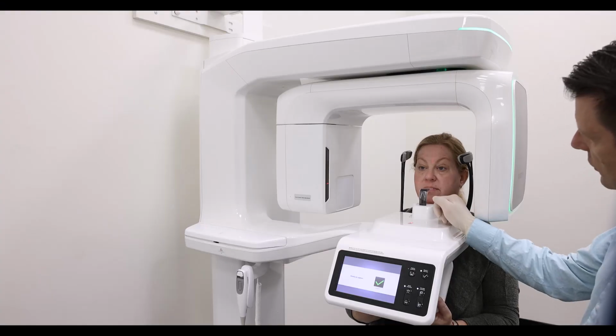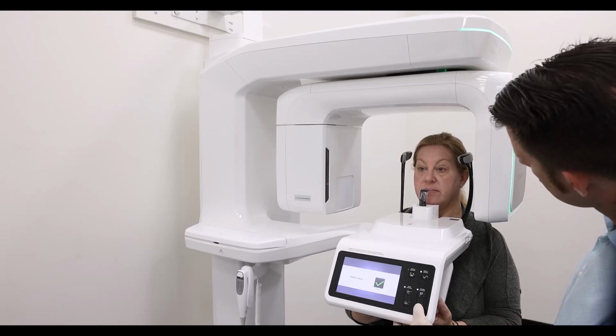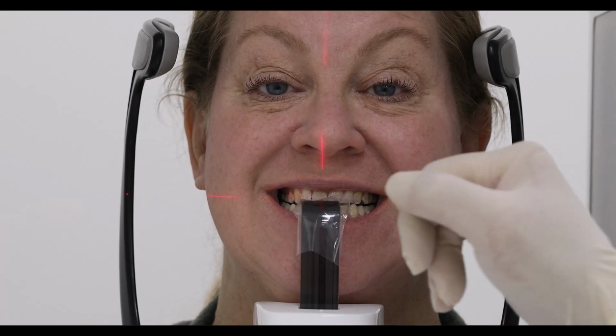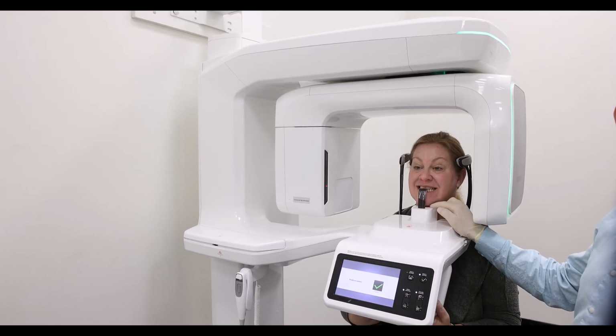I'm going to evaluate the chin rest to have that just below the patient's chin. Here I'm going to lower the column down just a little bit. Go ahead and open for me and bite on the bite stick. Smile really big, and I can see that the patient's biting in the bite stick groove. Really important, I can see that there's a little space below the patient's chin.